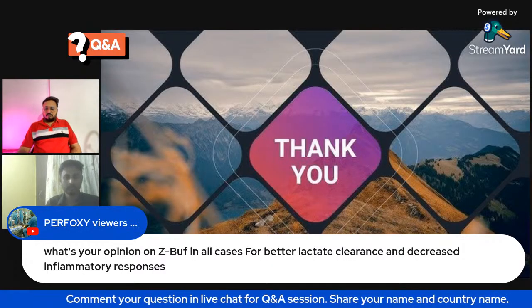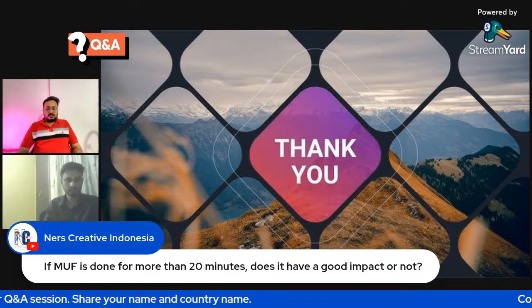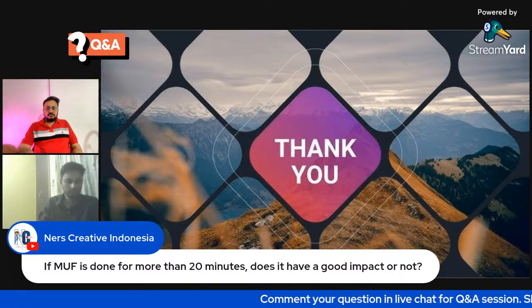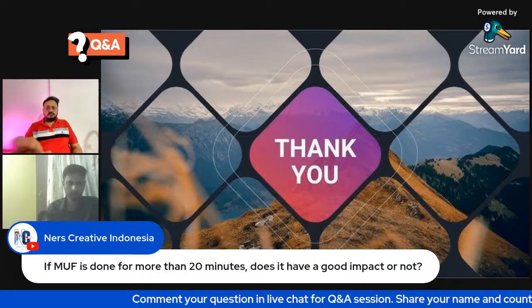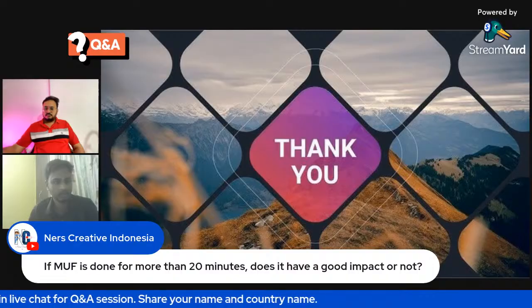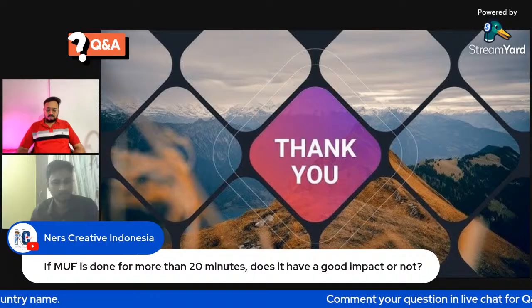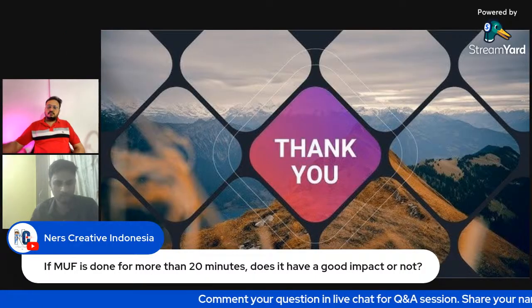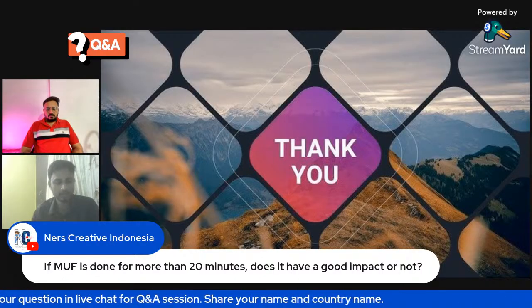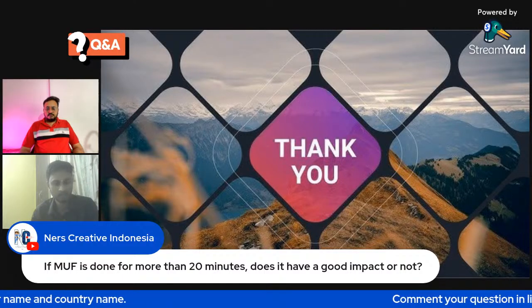Okay. So we have one more question. If MUF is done for more than 20 minutes, does it have a good impact or not? According to my experience, we are doing 10 to 20 minutes maximum, sir. But it's okay, if the arterial pressure is good, we can do it. It is good, but it will take more time actually. 20 to 30 minutes, 20 minutes above, will take so much time. Time management is not good actually.